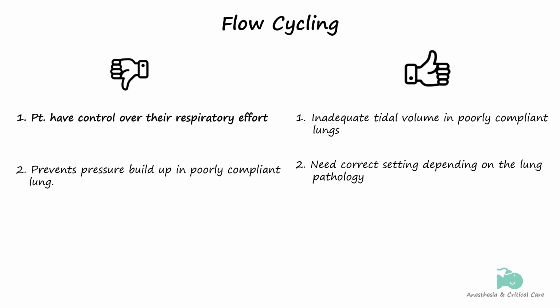Additionally, flow cycling is influenced by changes in lung compliance and airway resistance, which can help prevent lung overdistension. For instance, in patients with poorly compliant lungs, the flow decreases swiftly, prompting the ventilator to cycle to expiration and thus preventing pressure buildup in the lungs.